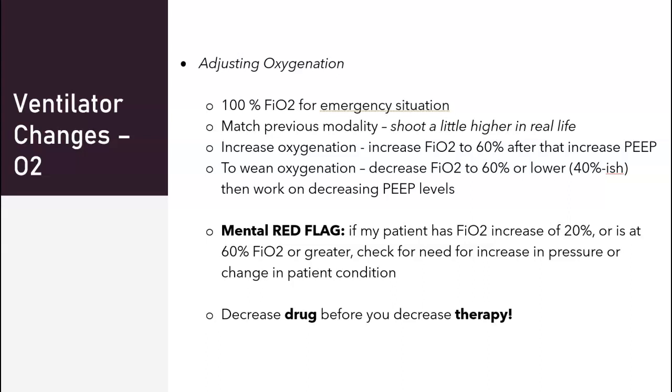On your boards, shoot to match the previous modality. I like to go a little bit higher just because why not? And then wean down.